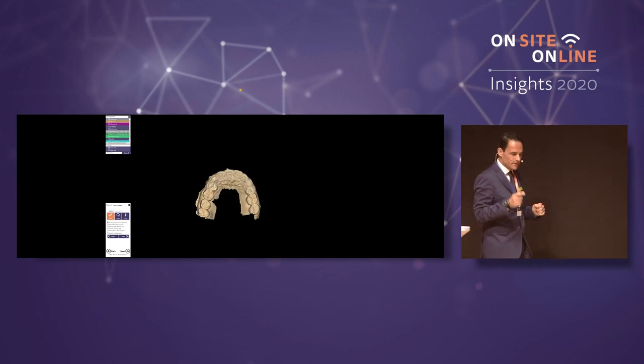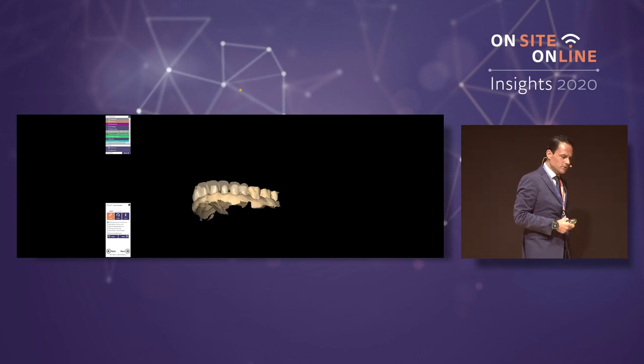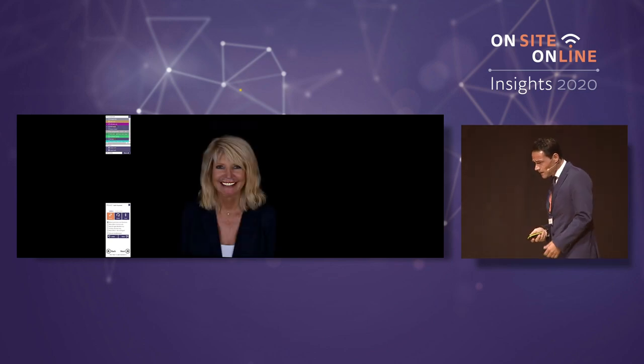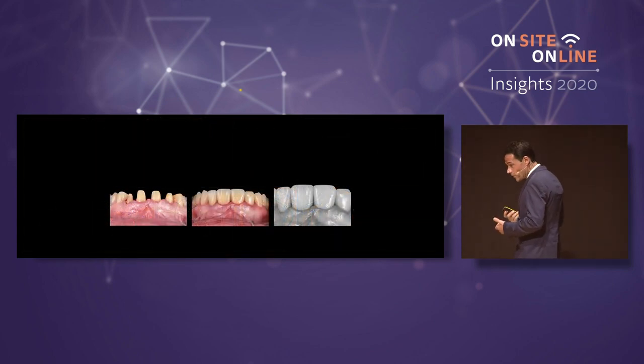I remember that I designed this case in Sao Paulo, and I sent the veneers to the laboratory. I have a machine with a loader, and when I arrive at the laboratory in the morning, I stain it and send it to the doctors. This is a very simple protocol. You can work very fast.